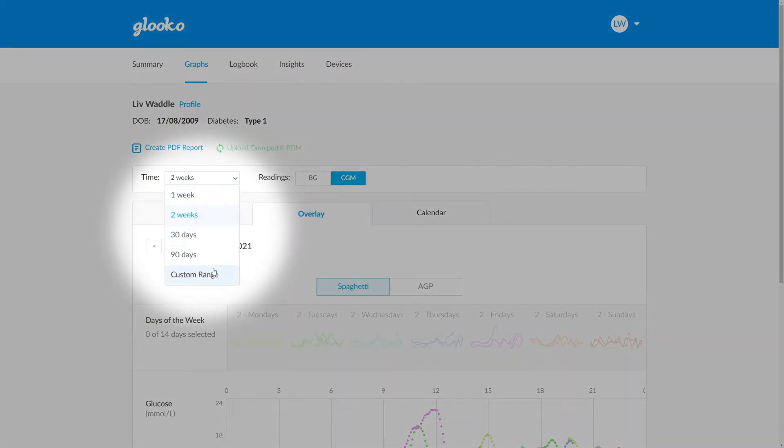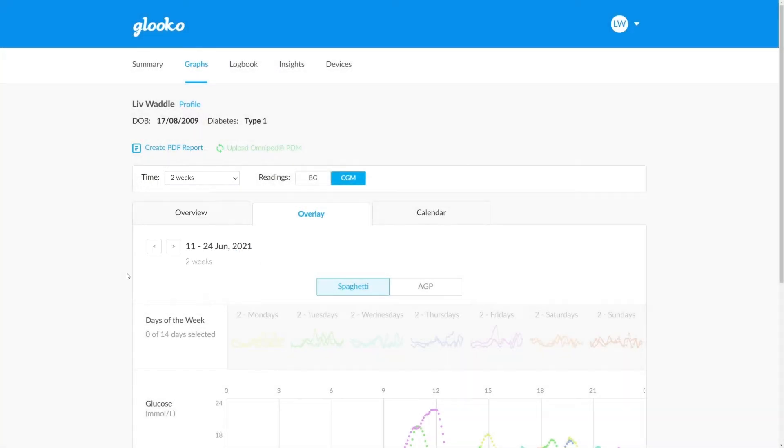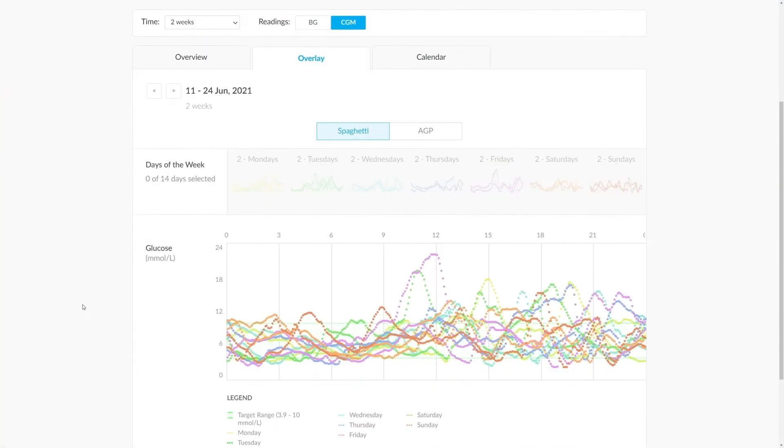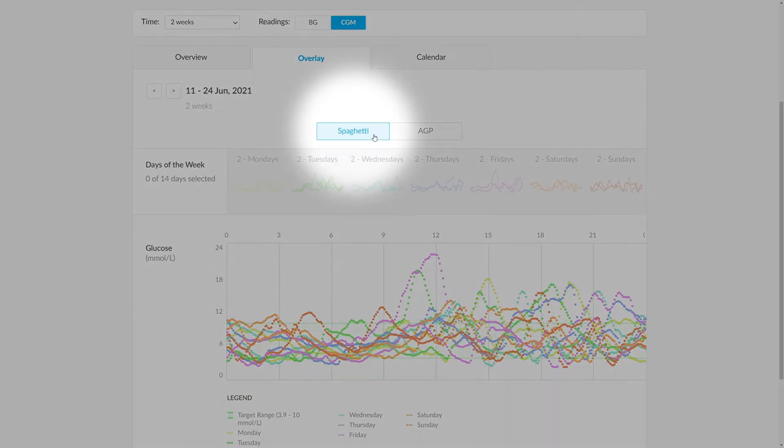We can select anything from one week to 90 days or even a custom time period. Once we've done this, we can look at the graphs below. We have the choice between spaghetti graph or an AGP, an ambulatory glucose profile.